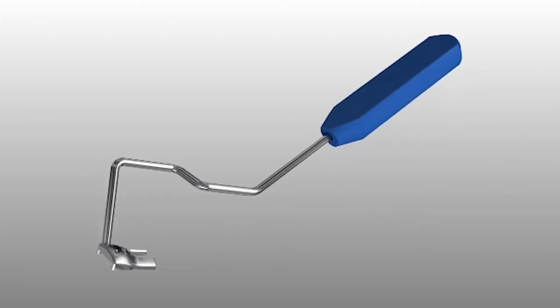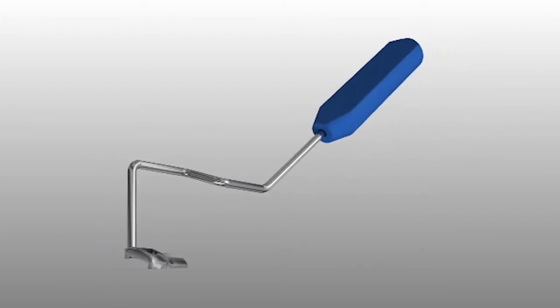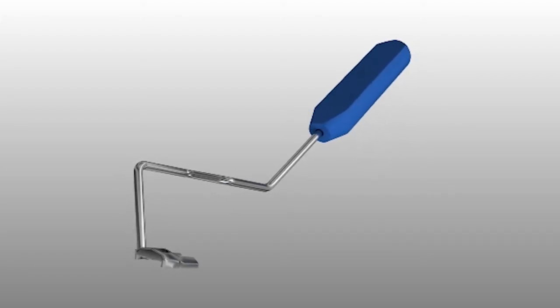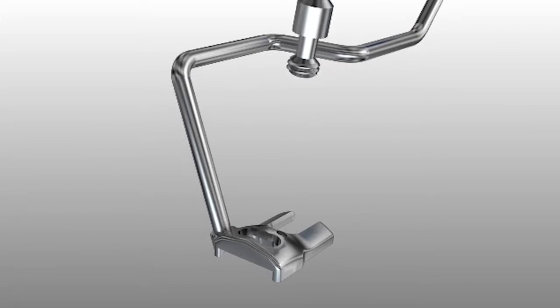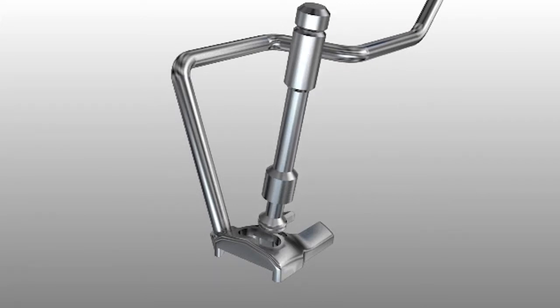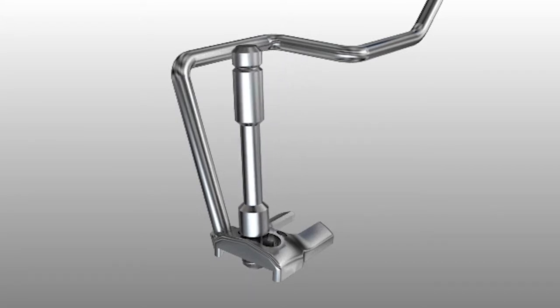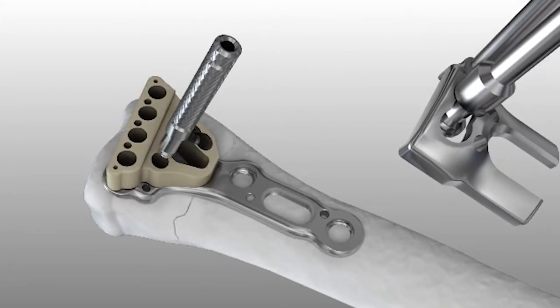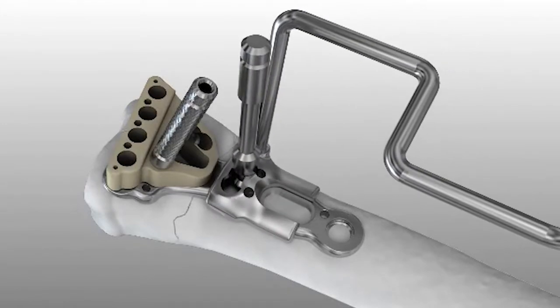The handle assists with precise plate placement while minimizing radiation exposure to the surgeon's hands. To utilize the plate positioning handle, thread the locking bolt into the left side of the keyhole on the distal end of the plate positioning handle base. Once threaded into the base, the locking bolt toggles to fit left and right plates. Thread the locking bolt into the most distal 3.5 mm locking hole on the shaft of any left or right AccuLock-2 plate.